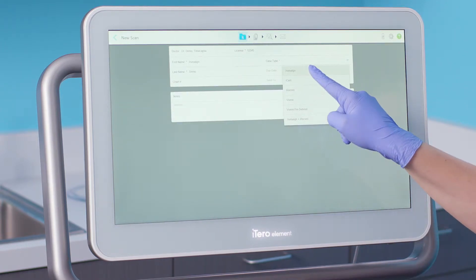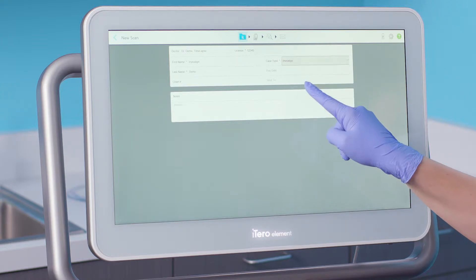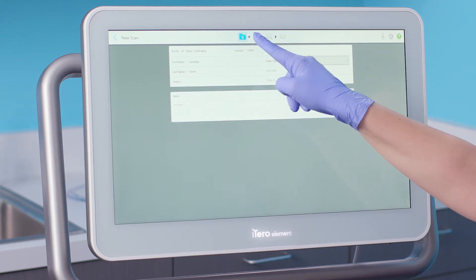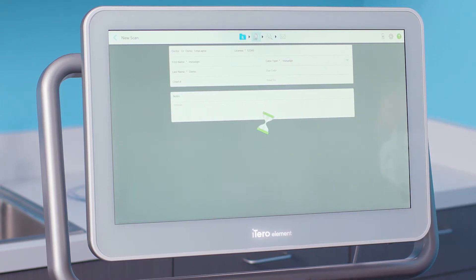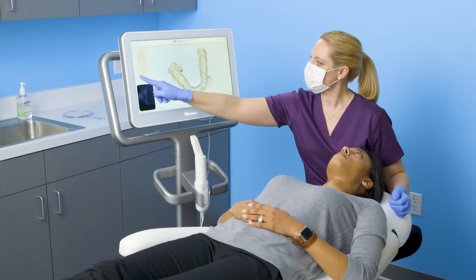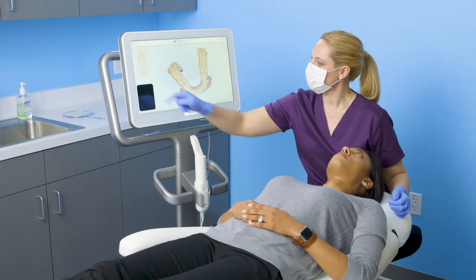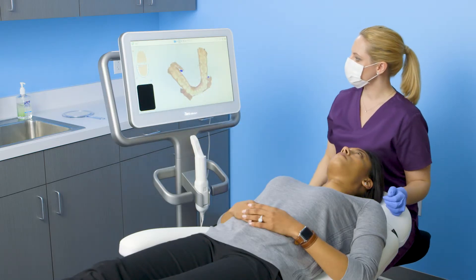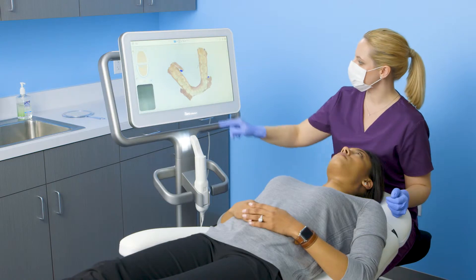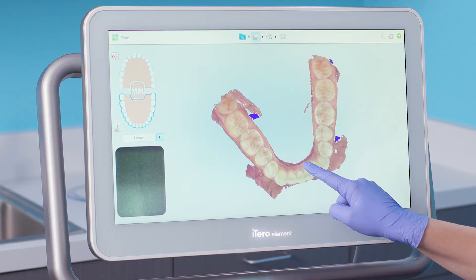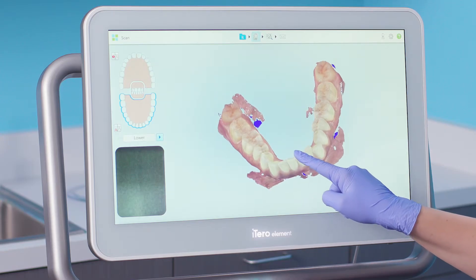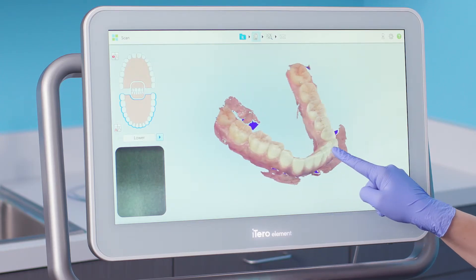In this demonstration, I will use an existing iRecord scan and add the Invisalign case type. I will review the digital model and, if necessary, add scans to capture the required anatomy.